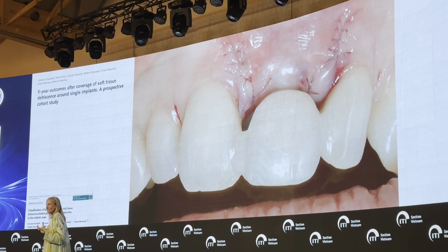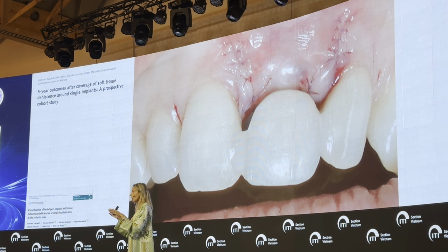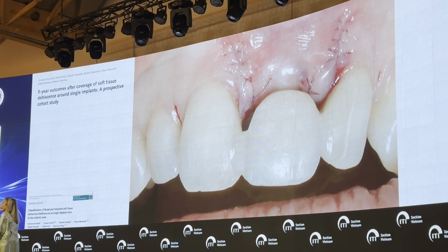When you coronally advance a flap to cover a bony block or titanium membrane with pin screws, you need a flap which is thick enough to withstand the first intention closure. And also, you need to raise this flap in a full thickness way, because you need to make the bone completely exposed. In all of these surgical procedures, what you are going to see is a split thickness flap elevation, removing all the muscle insertion from the inner aspect of the alveolar mucosa.